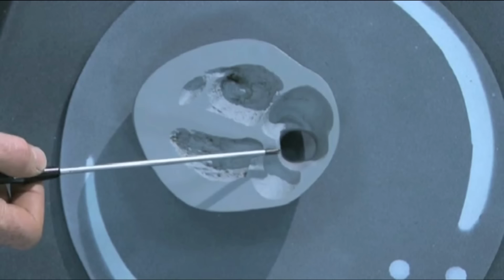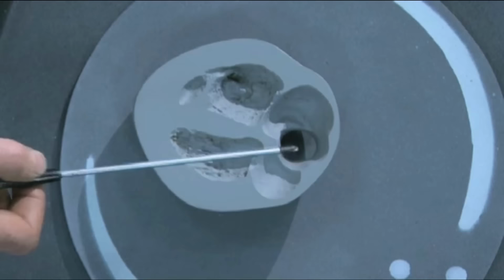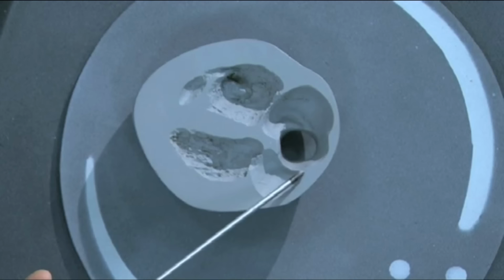Coming up the atrioventricular septum, there's the base of the interatrial septum. This tiny little piece of interatrial septum is the further confirmation that the crux of the heart is normal. Moving up the atrial septum, then you see the foramen ovale, and usually the top portion of the interatrial septum is quite difficult to see.